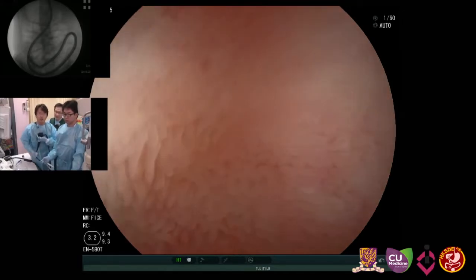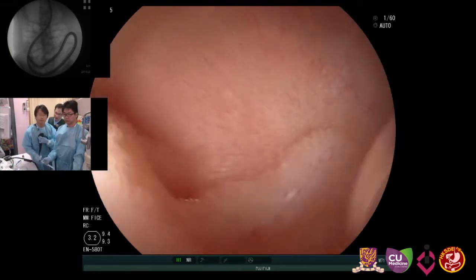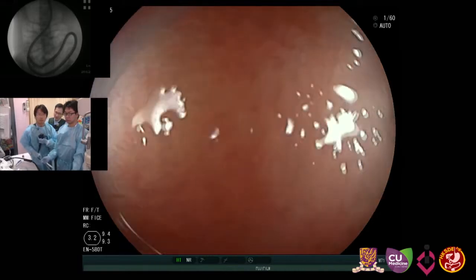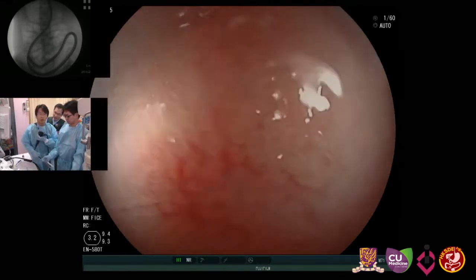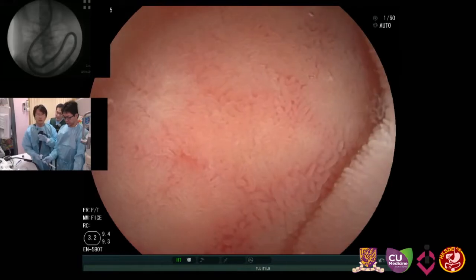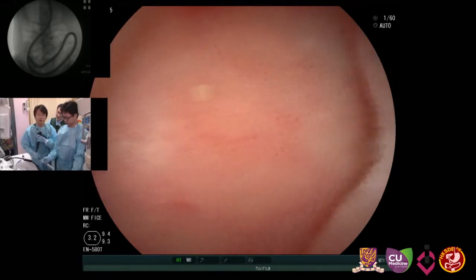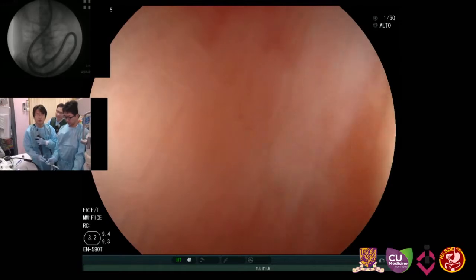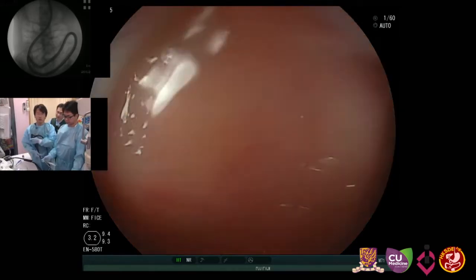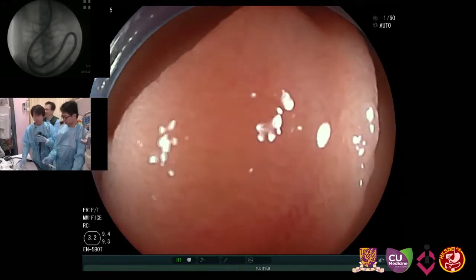But is it also posing a little bit of a problem catching the corners with the cap? Sometimes I find it a little bit more resistant when you're negotiating around the corner. Oh, and that's the reason why I often use the shaking motion to reduce the friction. I move the endoscope tip. Otherwise, it doesn't slip very well.